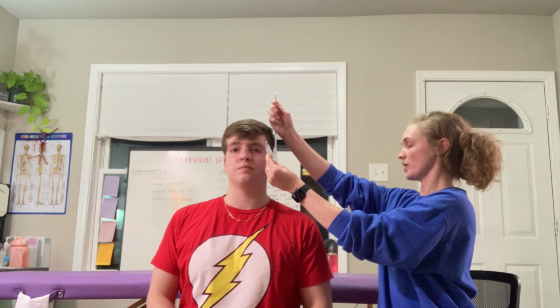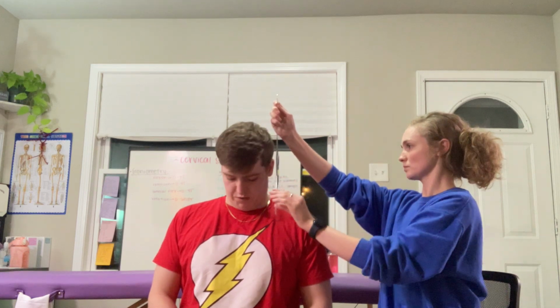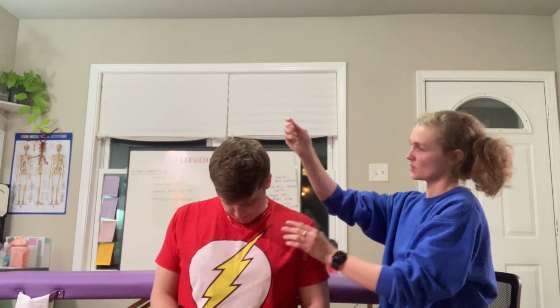Alrighty, whenever you're ready, we can do cervical flexion. Alrighty, our patient here has performed 80 degrees of cervical flexion, which would be much higher than the normal range of motion for cervical flexion, meaning that he may be hypermobile or just flexible.